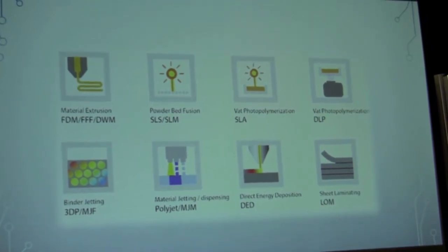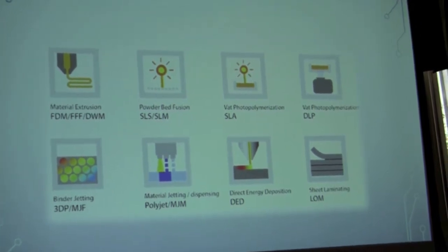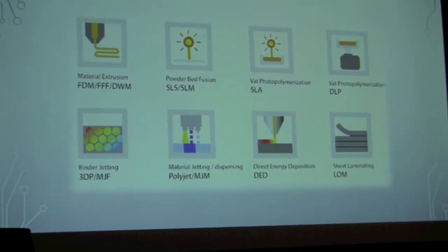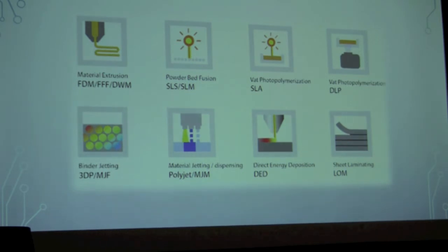We kind of see a little bit of binder jet printing in the dental industry. We really see PolyJet or material jetting dispensing. You see that with Stratasys 3D printers. 3D Systems has a material jetting printer. And another cool printer that's out on the market, I'm sure you guys have actually seen it, would be the Valplast 3D printer. So that would be like the FDM process.